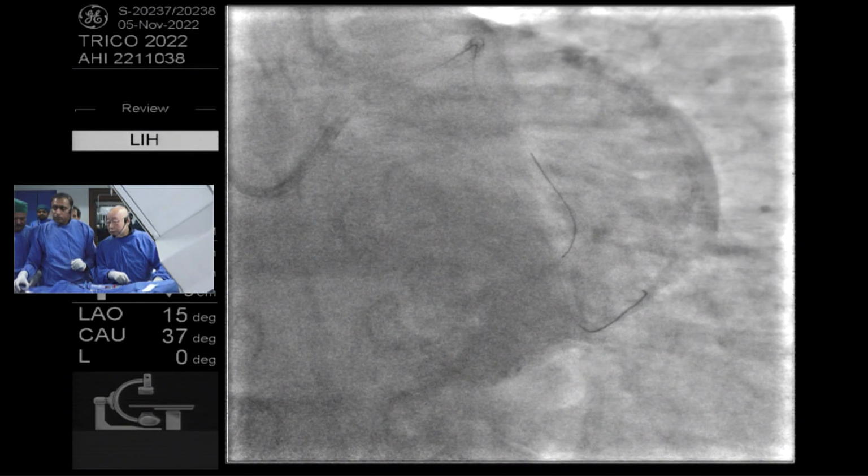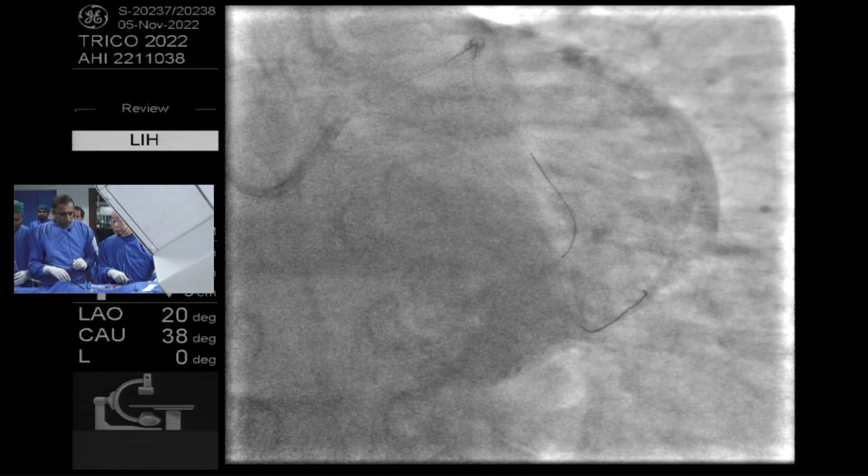After the big branch, the vessel diameter changes suddenly in this region. In this case, the CX supplies a huge area, right? Therefore, after the CX, yes, we can expect the diameter change in the proximal LAD. I agree, yes.